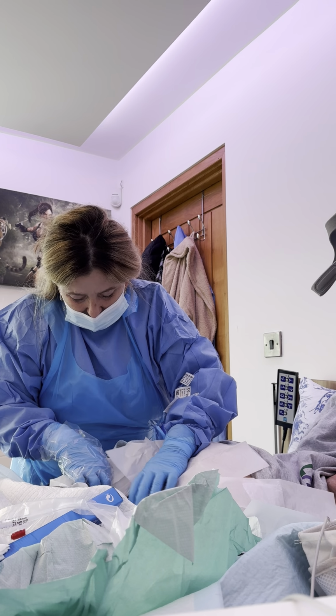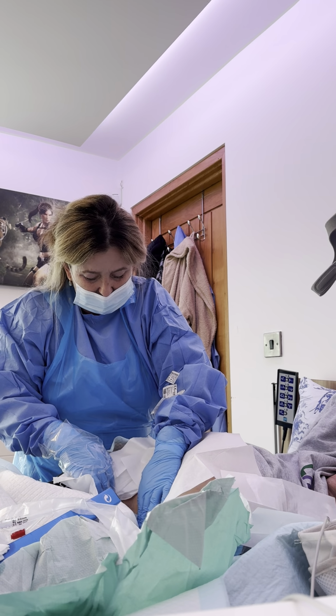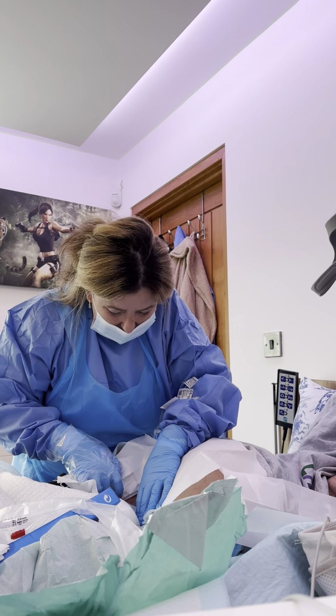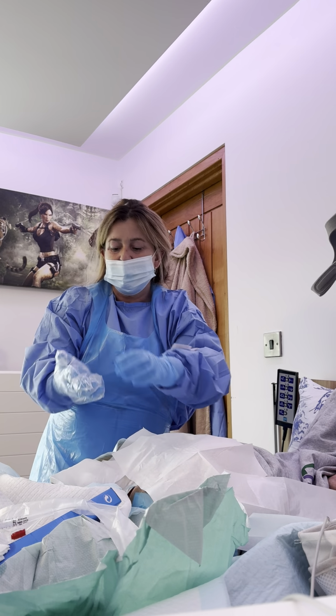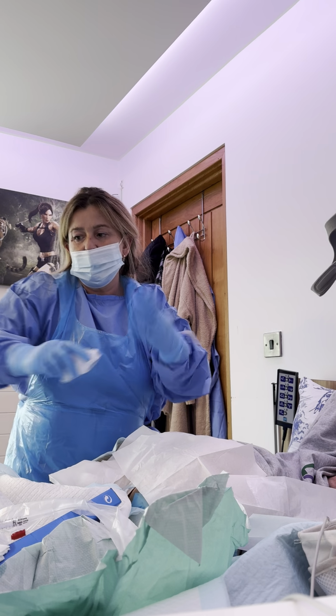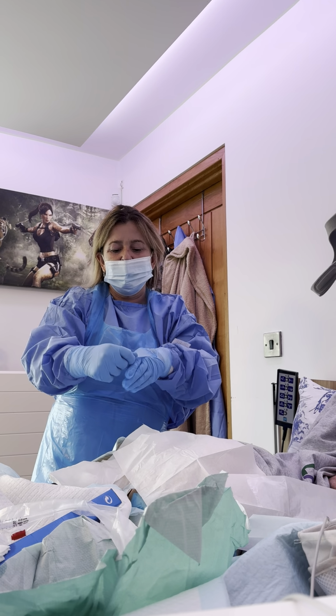So I did get a bit of retention. Not a lot, just a tiny bit. And the stoma is absolutely peachy perfect. So I'll take this glove off. I've got double gloves, and I'll take this glove off now. So one of these will come off.